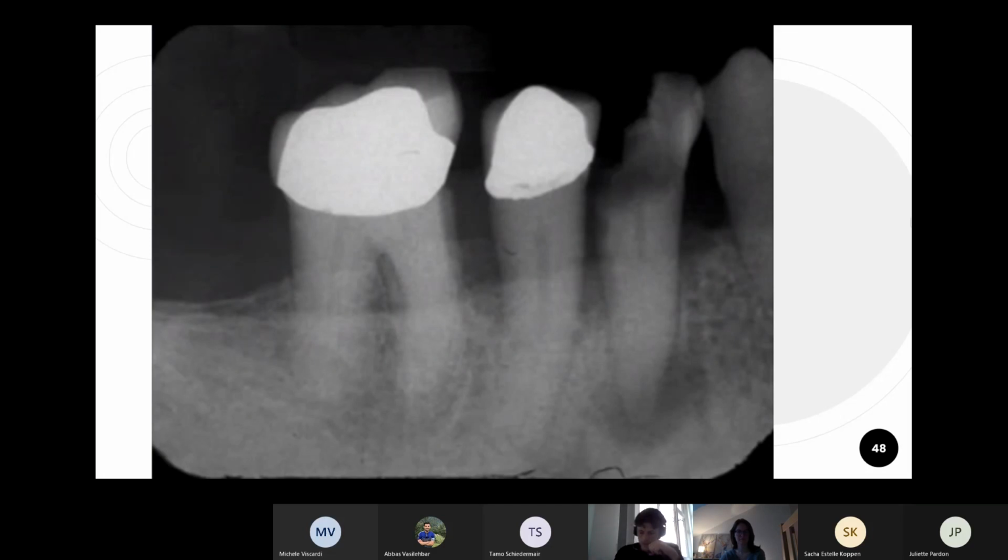All right, so here you should now mention that it's a different type of projection again. It happened to me in an exam once that I saw this and immediately thought bite wing, and of course that was wrong because it's a periapical projection. If you see the whole tooth like you do here, it's periapical. And usually I also just see one jaw, not both jaws like you do in the bite wing. This projection is usually used, like the name says, if you need to see the whole tooth until the apex, if there are some endodontical problems or periodontical problems.